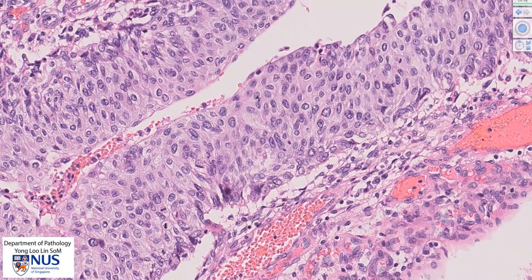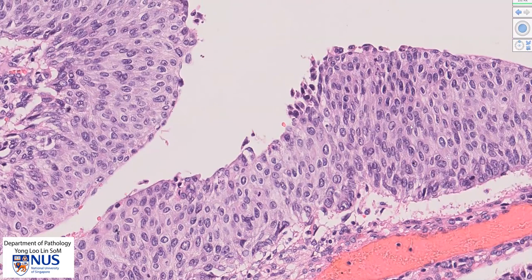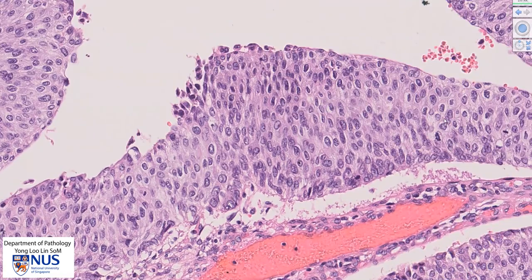In normal benign urothelium, we should only see mitotic figures right near the base or the basement membrane of the urothelium. However, here we can see mitoses that are quite superficial, going towards the surface. That is also a feature of urothelial carcinoma. Now let's look at another area where we can see the nuclear pleomorphism more clearly.